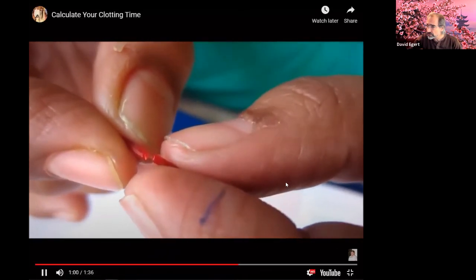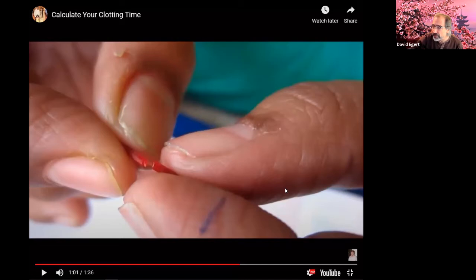If not, then... So there you can see he's actually got a little thread. Like his blood has clotted already here. If it hadn't clotted, you try pulling it apart and it's just liquid blood on either side. So this kind of gives you a sense of what this looks like.